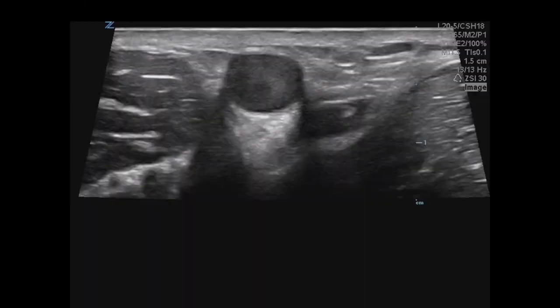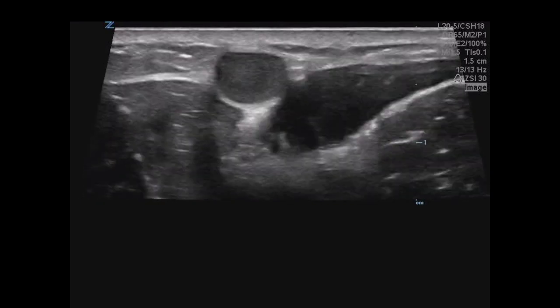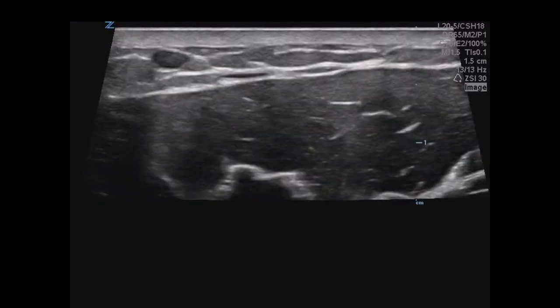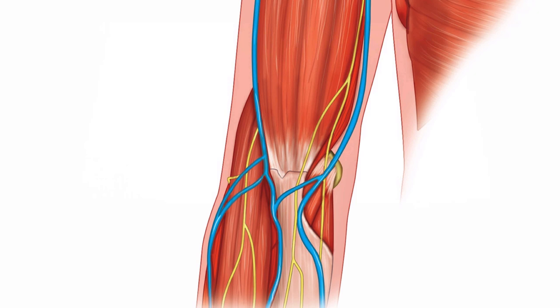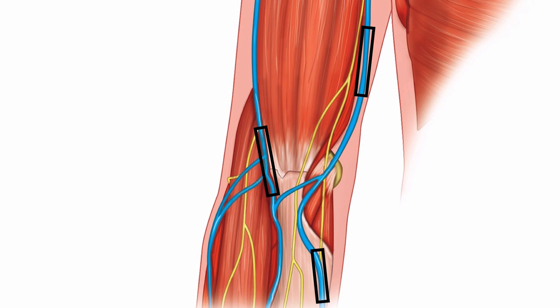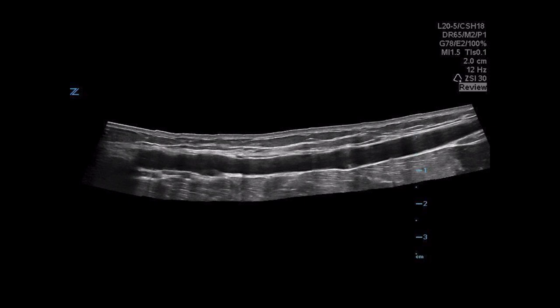When choosing the vein site, map out the vein by following the vessel both proximal and distal, noting the course and any branch points. The vein does not necessarily follow a straight line along the arm. Find nice straight segments of the vein that you can assess and access. Track along the vessel and identify a long, straight segment that you can localize, visualize, and cannulate.